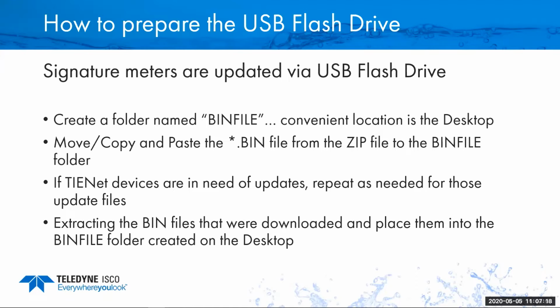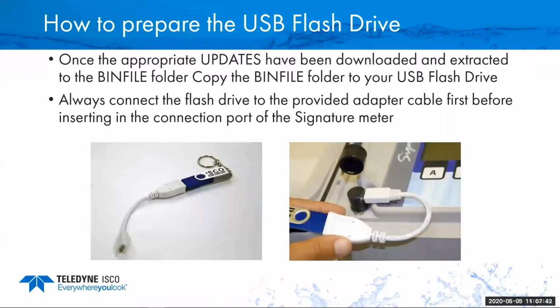If additional TiNet devices are in need of update, I will repeat this for every update that I am going to be utilizing with my equipment. I will then have all those bin files placed into that bin file folder that I've created on my desktop. You can also do this directly to a USB flash drive or some network drive, to each his own.